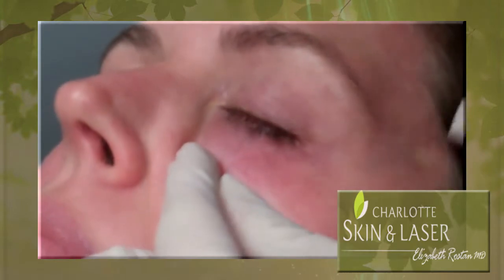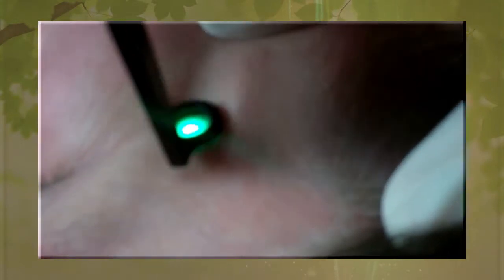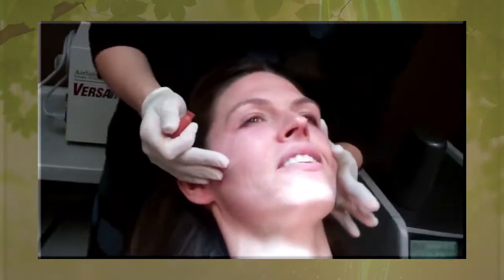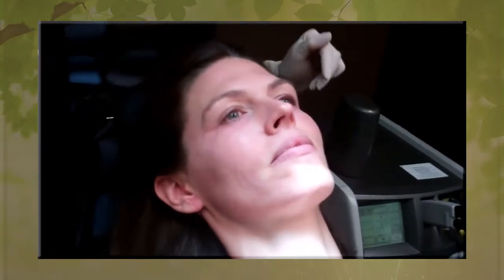We can't get every single one — it typically takes two treatments to get very good results. No bruising so far, but it can show up later. If a bruise does happen, it typically will last about a week.